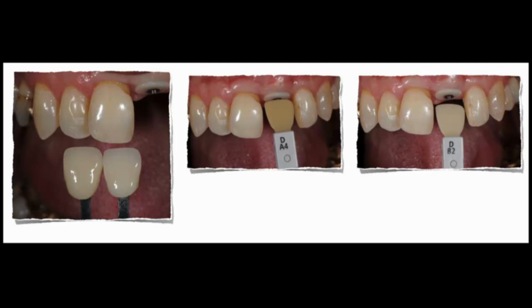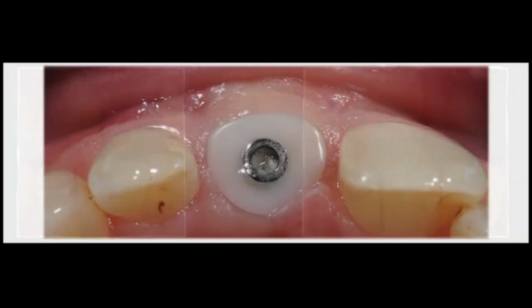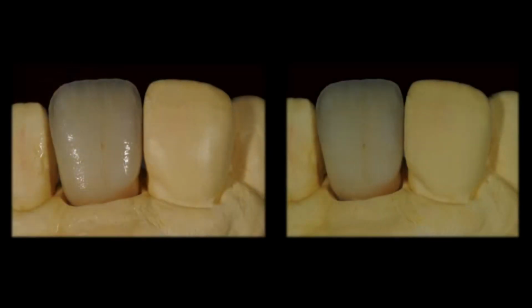We made it with CAD-CAM and a T-platform. Then we made the color selection. We took pictures. We used the cross-polarizing filter to see all the little hidden effects internally. And then, yeah, the patient came. We took pictures. We made the abutment, an individual abutment, bonded on a T-platform. And then finally, we got the first case.